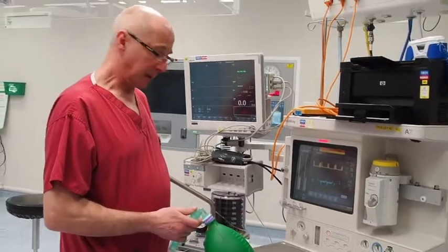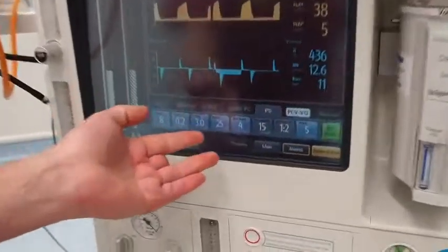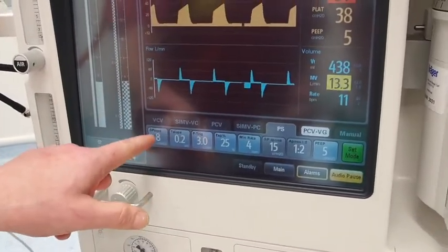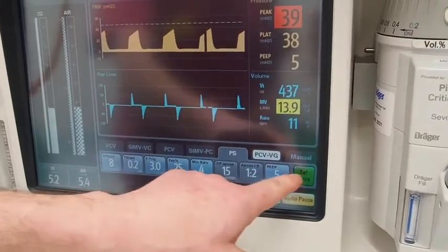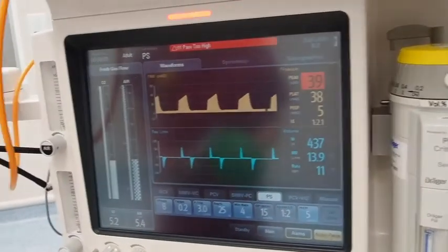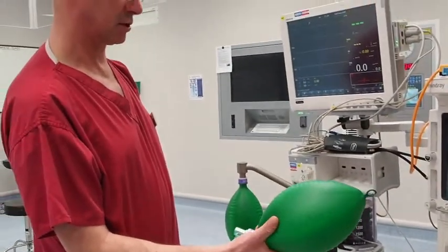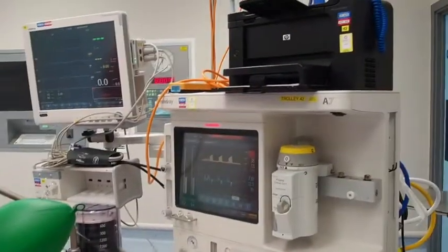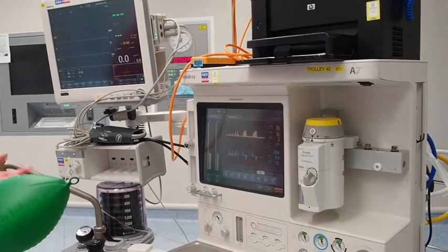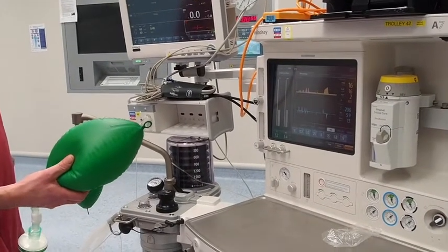When we come to weaning the patients, it'll be a case of going on to pressure support. And the pressure support numbers are very much the same as you would have in an ITU ventilator. So that's pressure support of 8 on a PEEP of 5 with a backup. You press set mode and the patient won't ventilate, but there's an apnea backup. As soon as the patient triggers a breath, then the bellows move. And it's just like an ITU ventilator, except you can actually see the mechanics of the machine working.